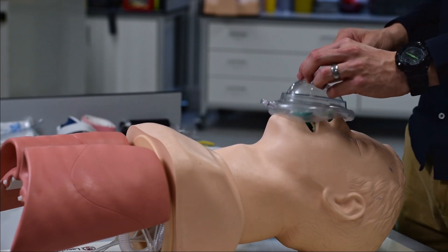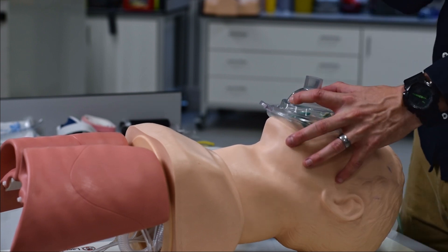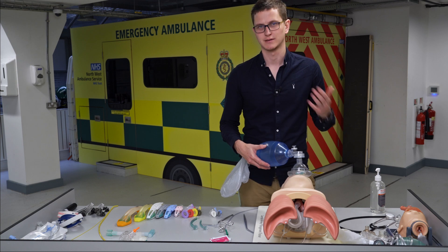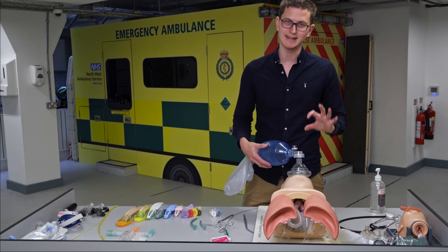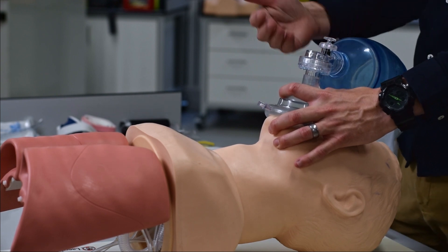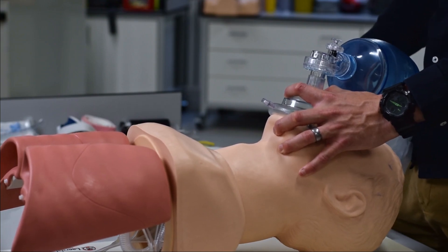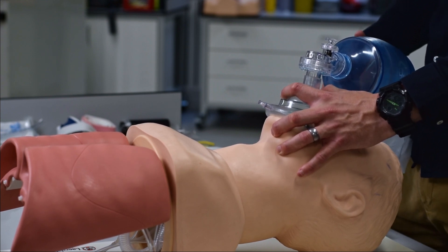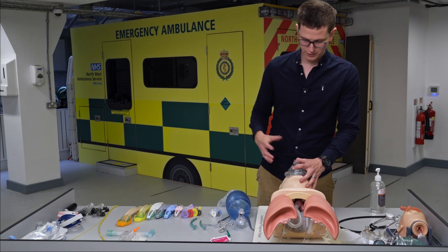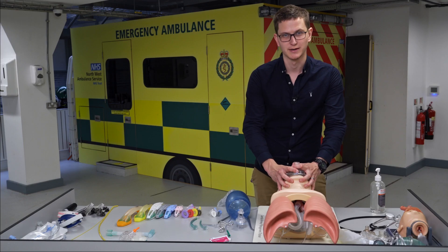To use the BVM: the mask goes over the face — the pointy bit is for the nose and the wider part for the mouth. A BVM should ideally be used by two people. To hold it solo, use a C-E grip — the C goes over the mask and the E grabs the mandible. This is not pushing the mask onto the face; it's bringing the jaw into the mask. A double C-E grip with two people gives a much better seal and guarantees good ventilation. We only confirm good ventilation if we see chest rise.